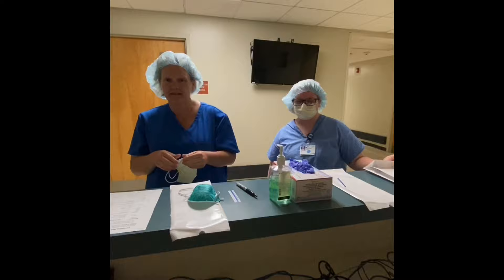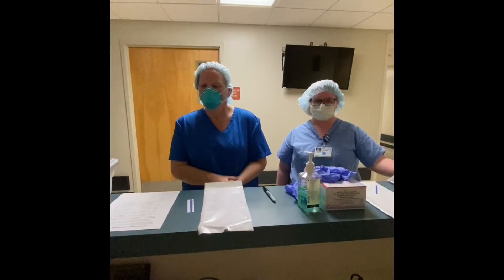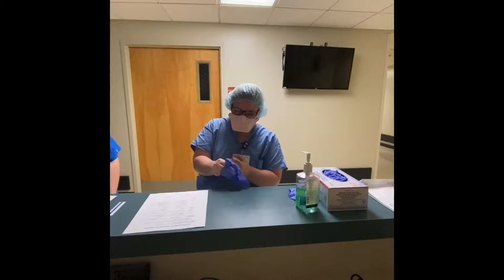I wanted to take a few minutes to talk with you about how to reprocess... stop. We should have got this first try. Alright, so now we're going to doff the mask. In order to do that, I've got to put on gloves for safety.